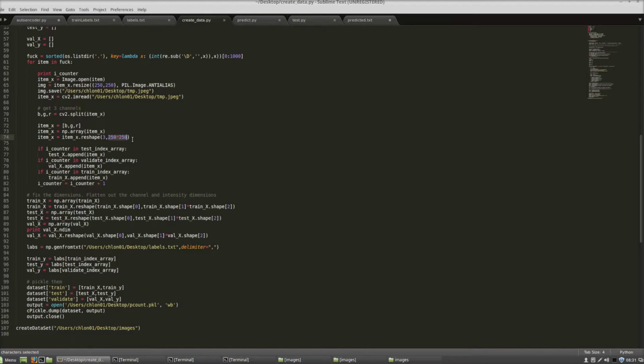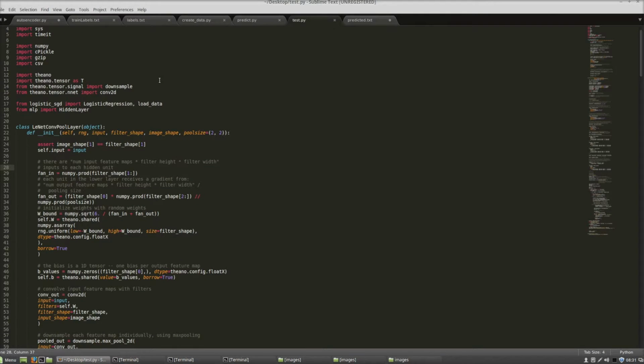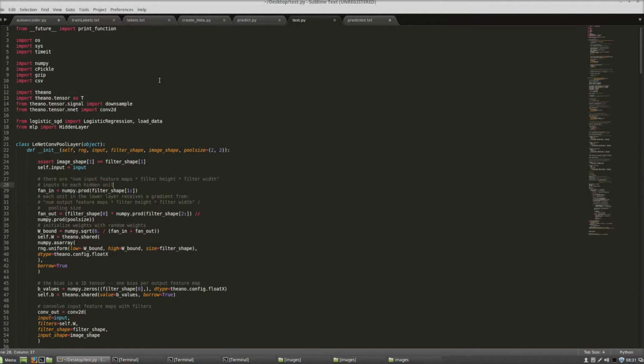So this is where it all happens. This is our convolutional neural network. This is written in a programming language called Python, using a toolbox called Theano, which is a very powerful machine learning toolbox that represents the gold standard these days in writing machine learning code. We wrote our own implementation of the convolutional neural network, and we selected an architecture that we could optimize such that we get the best classification results and minimize the error.